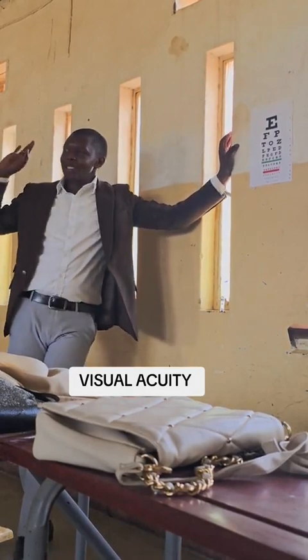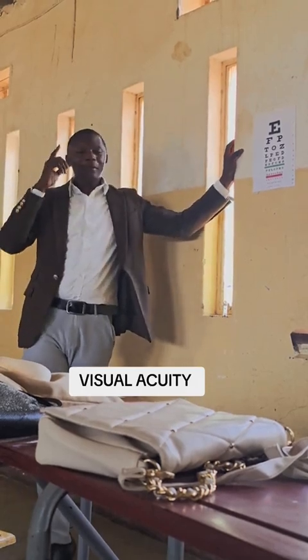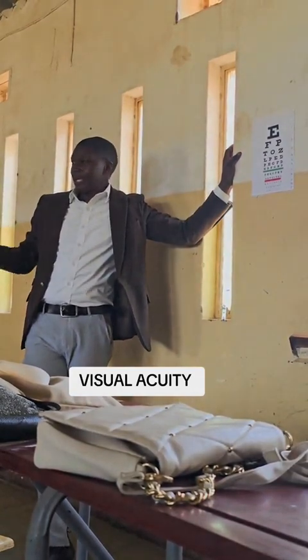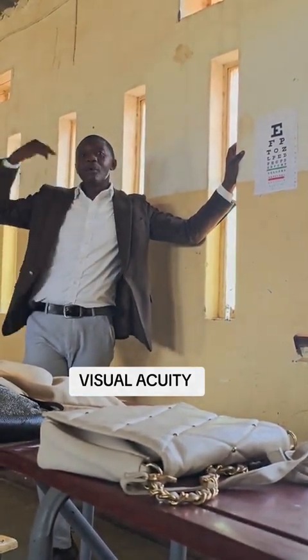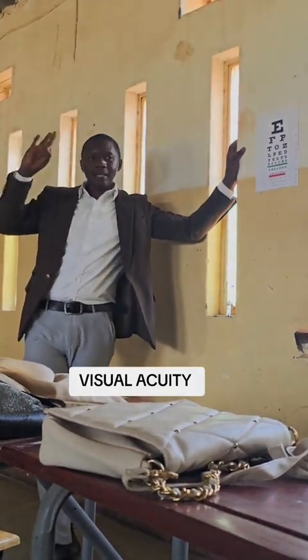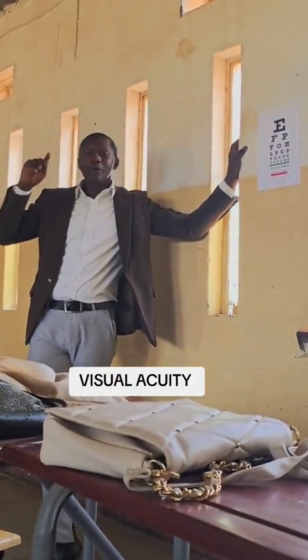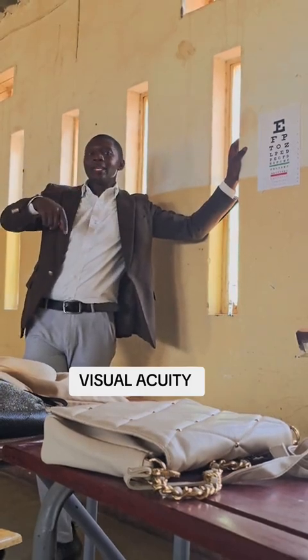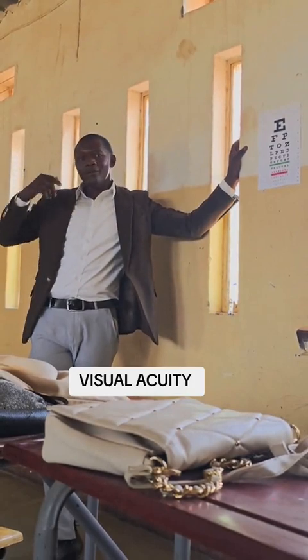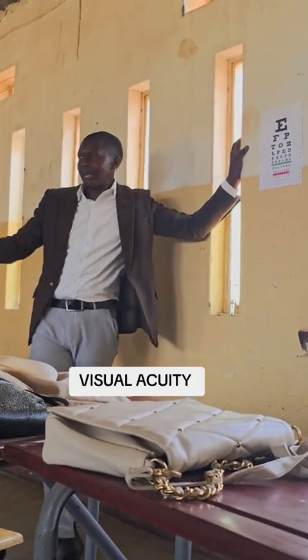I'm saying if the patient is able to read 3 letters in that line, meaning when recording for that eye, you are picking the actual line. That's if they are able to read 3 letters or more in that particular line. But where they are able to read less than 3 letters, meaning it could be 2 letters or 1 letter, you are not picking the line where they have ended, but you are picking the previous successful line over 6 plus the letters that they read in the line where they ended.